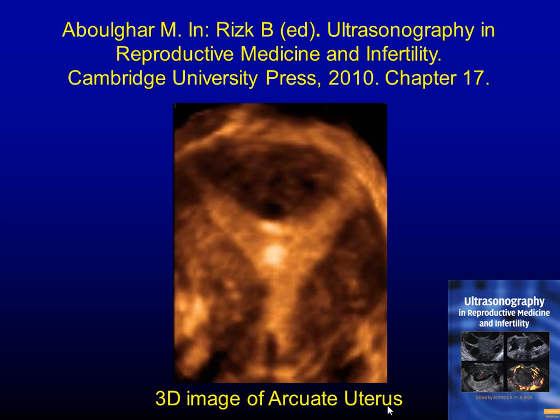The problem is that if you keep cutting more, you will come to a point where you will make a perforation at the fundus. If you make a perforation at the beginning of the case, it ruins the case because the fluid will leak and you cannot continue your hysteroscopy. But if you make a perforation at the end, it is really of no sequelae whatsoever.